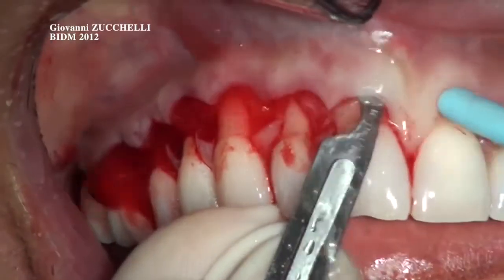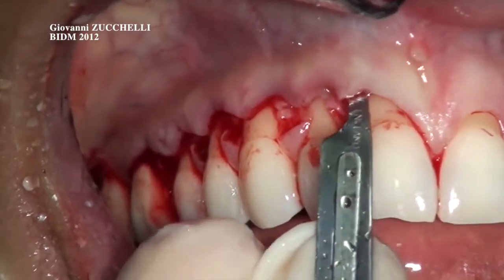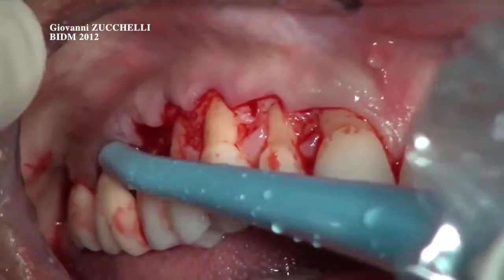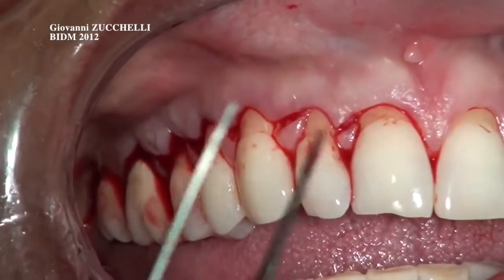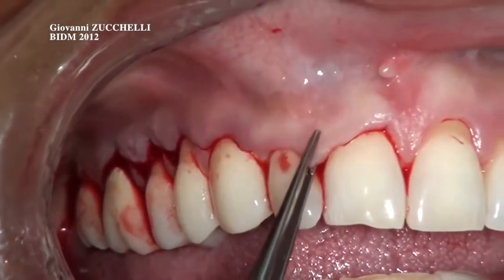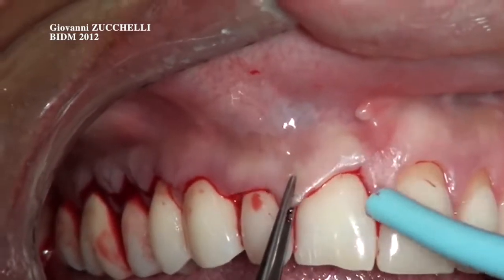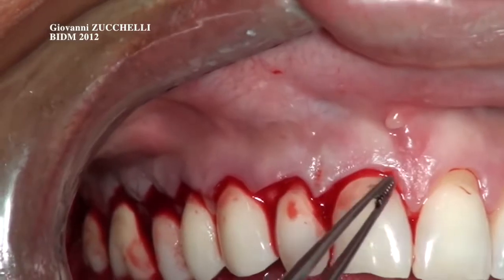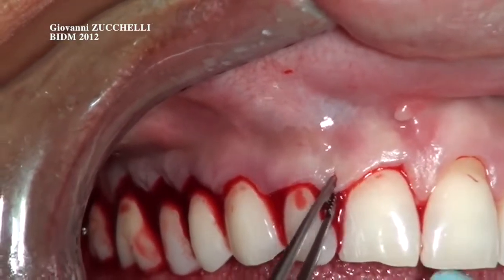Superficial means removal of all the superficial insertions of the muscles, apical. Now you look if this is enough, take the pincette and try to rotate this papilla in order to cover the central incisor. You see that there is something that doesn't work here. There is like a cleft area in the central incisor.